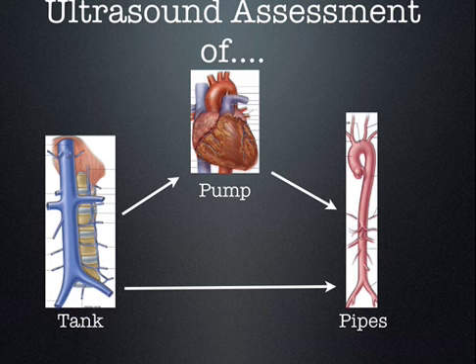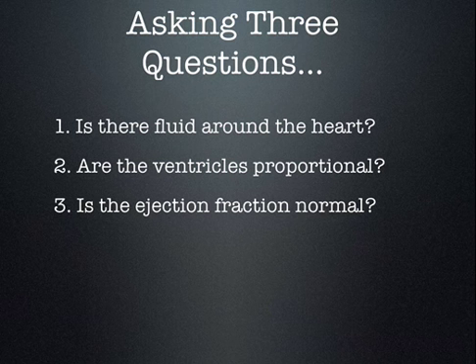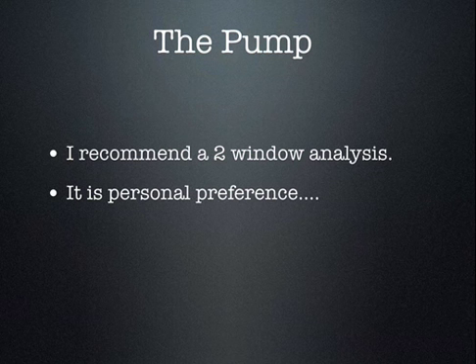All right, so now we're going to move on to the pump, to the heart, okay? And we're asking 3 simple questions. We're not cardiologists here. We're not trying to replace the cardiologist. We're asking 3 very simple questions. Is there fluid around the heart? Are the ventricles proportional? And is the ejection fraction normal?